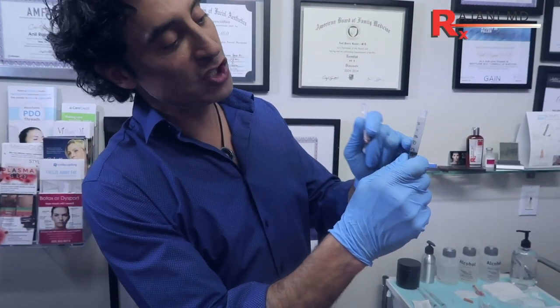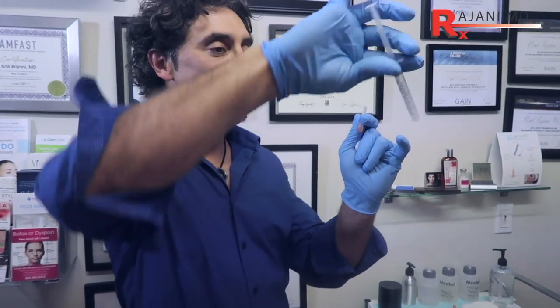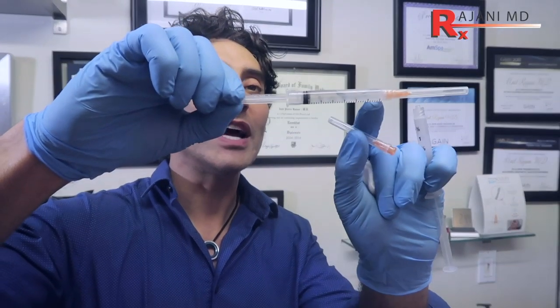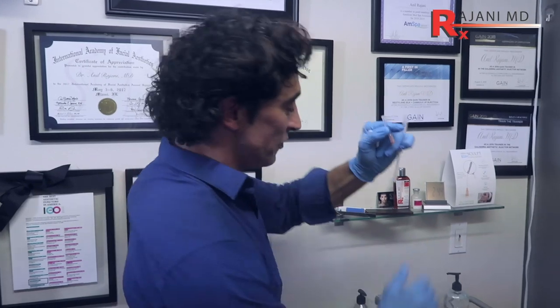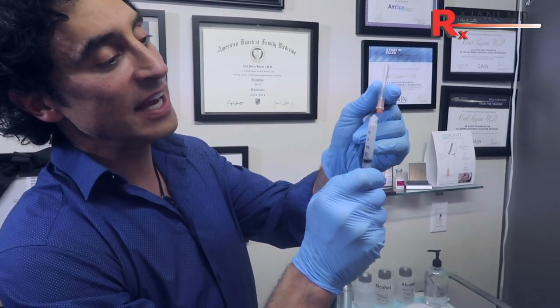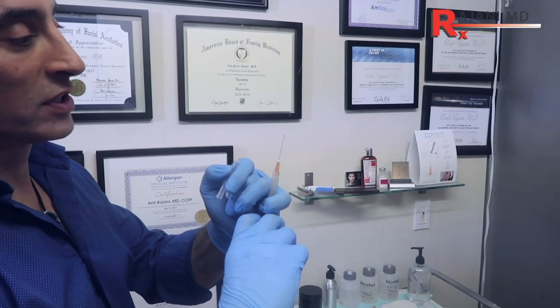Temples are part of the frame of the face, very important for a natural lift — it lifts the edge of the eye and patients love the results. Getting Sculptra mixed: you put air in it and you have to do this before injection, because if you look at the ones that are lying down, they have Sculptra in the bottom. When you inject that, that's a nodule. Mixing it properly, getting the air out, putting a ball of fluid in the top, making sure it works — then you can inject.